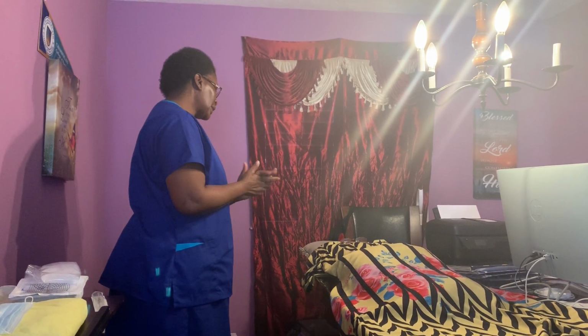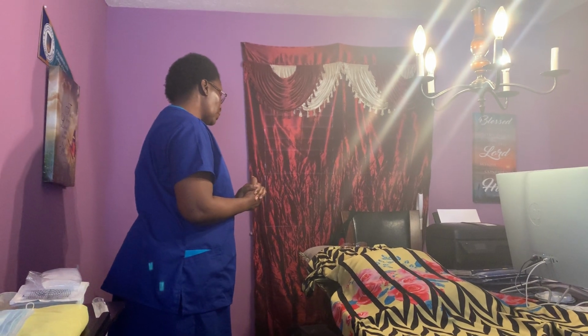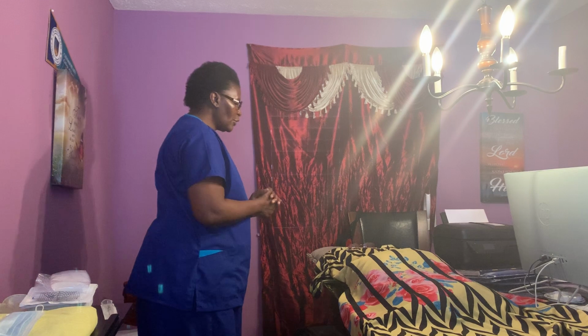Okay, so before we start, can I just verify your two identifiers? Tell me your name and your date of birth. Let me check your name back. Okay, thank you very much. I've already gone to verify your doctor's order, and the order tells me that I should be doing a wound change this morning. Take away the old one and put the new one.